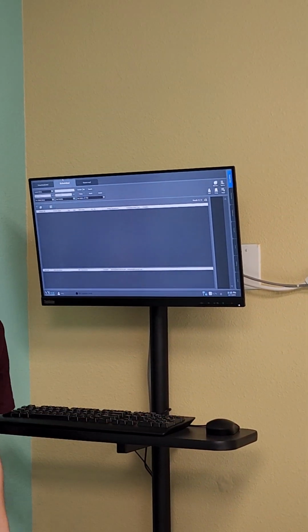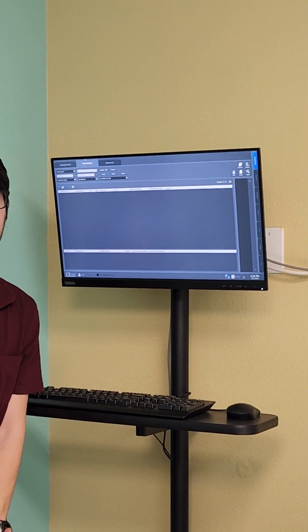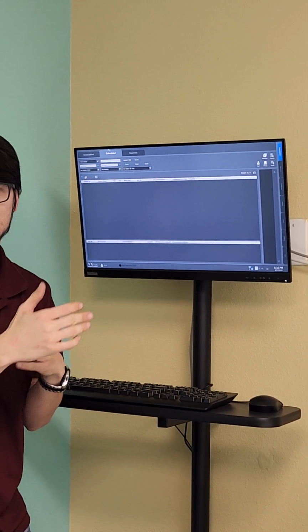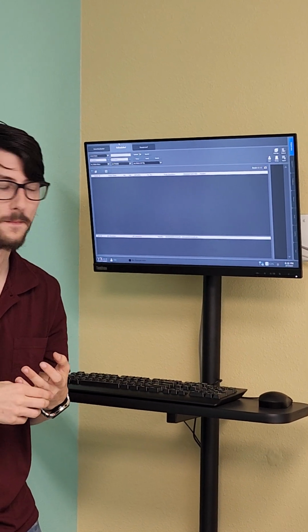Scheduled is if y'all had a work list. I'm not sure if y'all do, I don't think so. Where if y'all insert a work order, it'll automatically get sent here and populate all the patient information. I don't think that works like that. I don't think they talk like that yet.